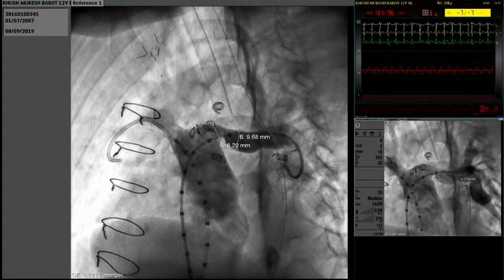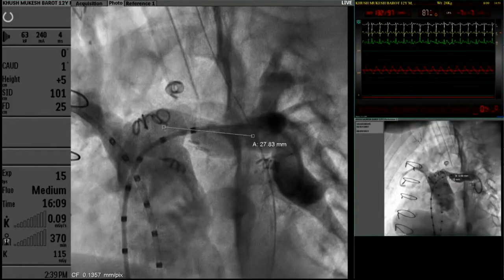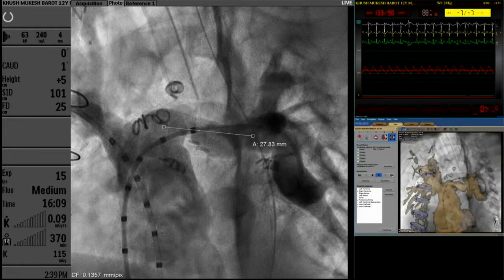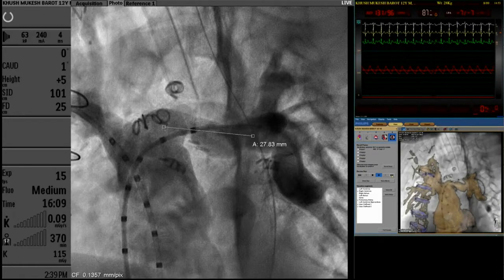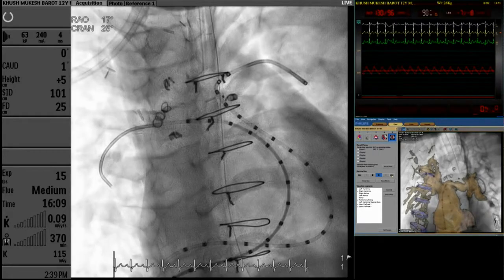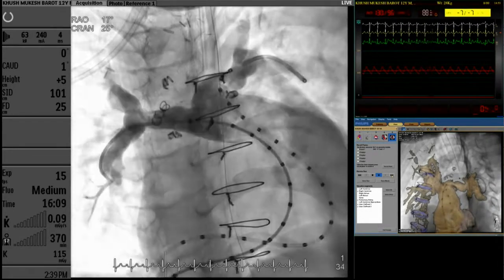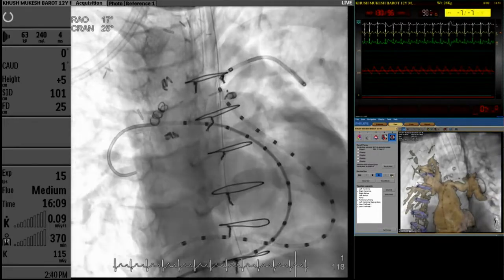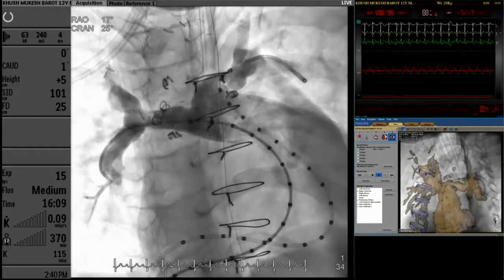So now what will be the plan on this patient? Obviously, we have to stent it because the right pulmonary artery has been repaired previously with a Gore-Tex tube graft, and then the Gore-Tex tube graft has been cut longitudinally and patched with a bovine pericardium. So part of the circumference is Gore-Tex patch and part is bovine pericardium on the right side. On the left side, it is all native pericardium, because during the transannular patch, the pericardial patch has extended into the LPA origin, which is causing an LPA origin stenosis.